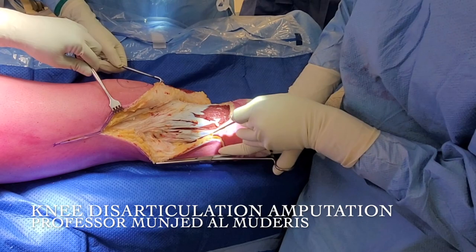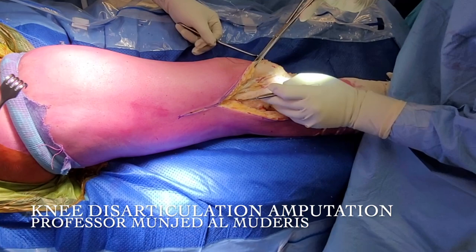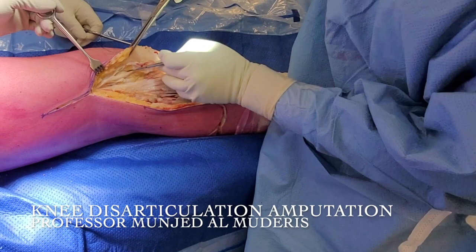This procedure should not take too long, especially in the presence of a tourniquet and CRPS. The less hypoxia to the tissue, the more ideal the situation is. We have previously performed proximal targeted muscle reinnervation for the femoral and the saphenous nerve to reduce the level of CRPS, so I'm not worried about the saphenous nerve distribution at this level.